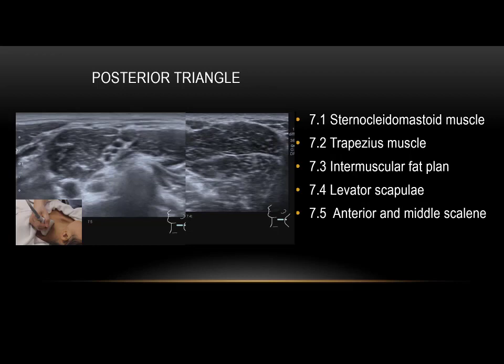So look at the ultrasound-related anatomy that I described earlier. We have to look first at which one is the edge of the sternocleidomastoid or the edge of the trapezius muscle. In this ultrasound view, we just stitched the images into one plane to cover the edge of the sternocleidomastoid and trapezius muscle. In reality, the linear transducer is not large enough to cover both edges, so we stitch it to see the whole thing.